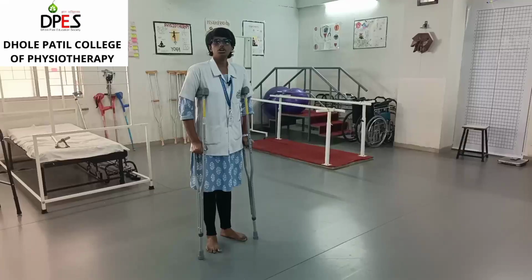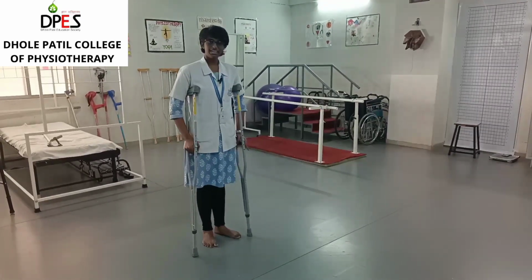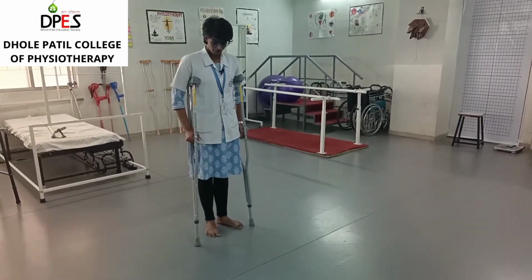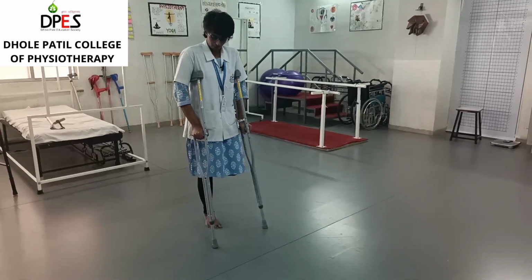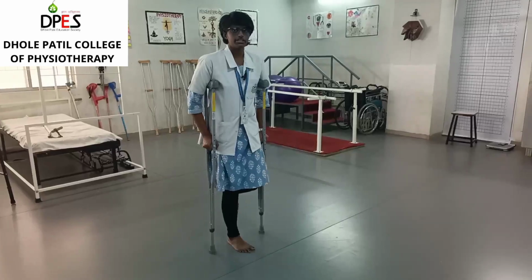Next one is non-weight bearing. So if my left leg is affected, I am going to just take both the crutches forward and I am going to put all my weight on the hand grip and take my non-affected leg forward.